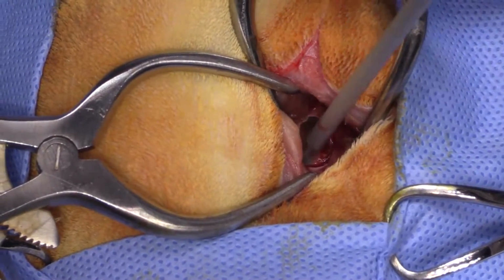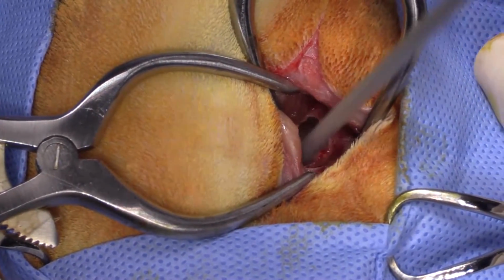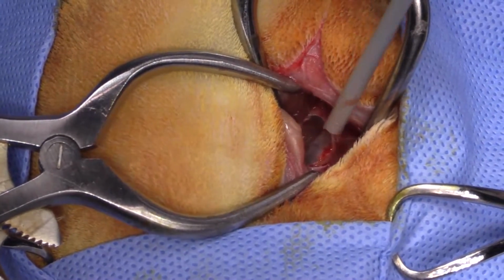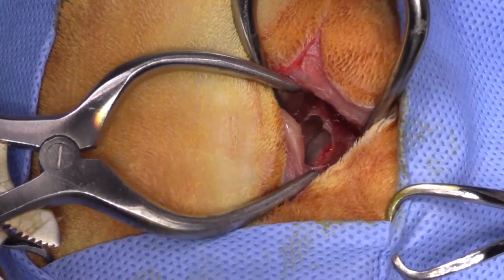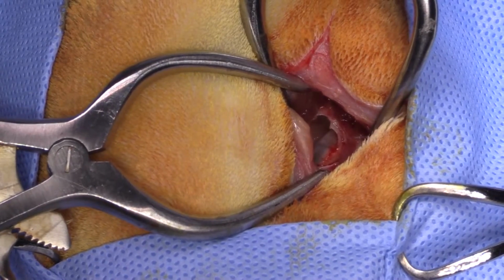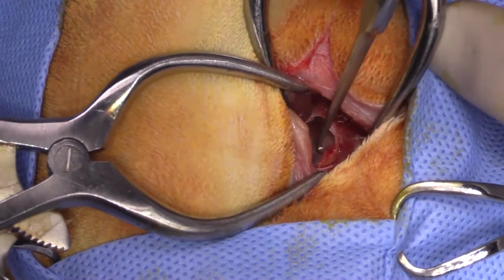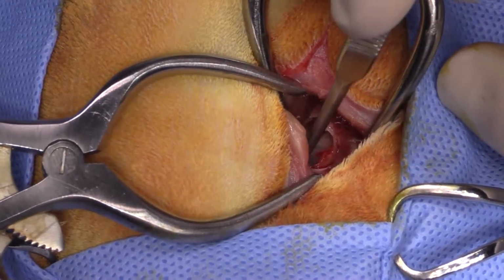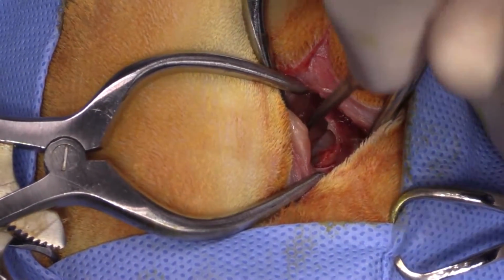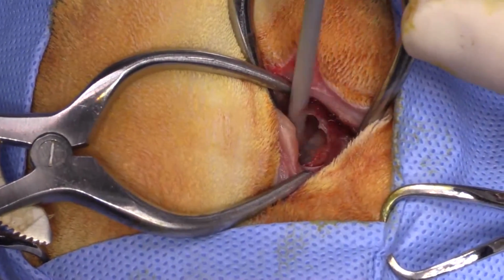It's very difficult to avoid getting Horners in these guys because the sympathetic trunk lies right in the middle of the tympanic bulla, right on that promontory between the ventromedial and dorsolateral chambers. So it's very common that you're going to get Horner syndrome in these guys. Horner syndrome isn't painful and it doesn't cause any visual deficits, so it's not something to be too concerned about. And then we want to make sure that we don't damage the vestibular apparatus by going too far dorsal in our dissection.